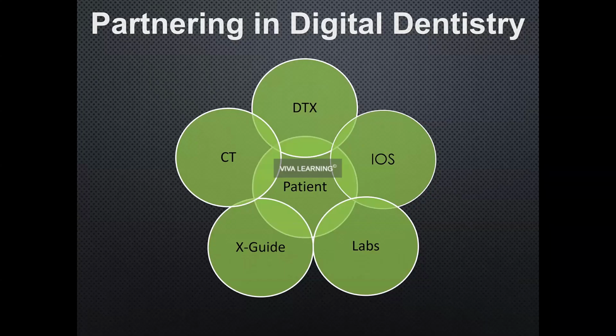When we're talking about digital dentistry in the implant arena, you've got all kinds of different circles that are going to make our whole experience worthwhile. First off, we've obviously got to start with the patient, but then you're going to need your CBCT, which I think pretty much now is a standard of care.